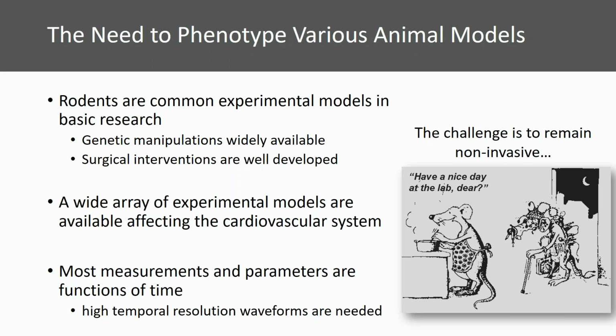And of course, it is important that we be able to phenotype those models, which is the main goal of Dr. Reddy's lab at Baylor. Many of these measurements or parameters that we're looking for are a function of time, and thus high temporal resolution waveforms are needed. And you'll see exactly how the Doppler system is able to do this.